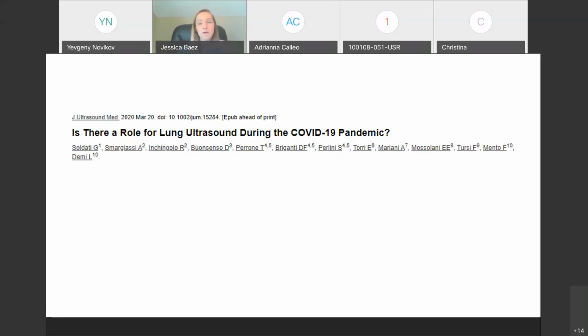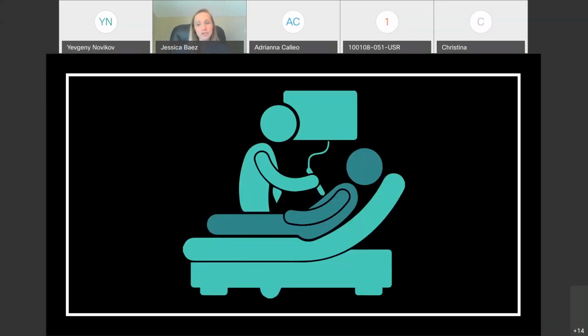So the potential benefits of lung ultrasound are quite broad. And I would argue, particularly in the medicine realm, when you guys are on the wards and don't necessarily have access to a chest x-ray within a couple of minutes, it can give you a lot of data up front that can help you target your therapies in a more appropriate manner. All right, questions about some of the data behind it before we talk about how to perform this? All right, I'm going to take the silence as a no, but again, feel free to interrupt if you have questions.